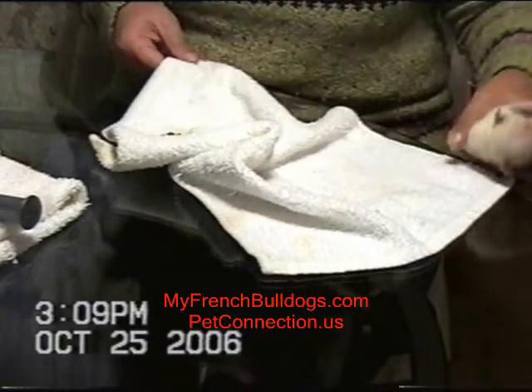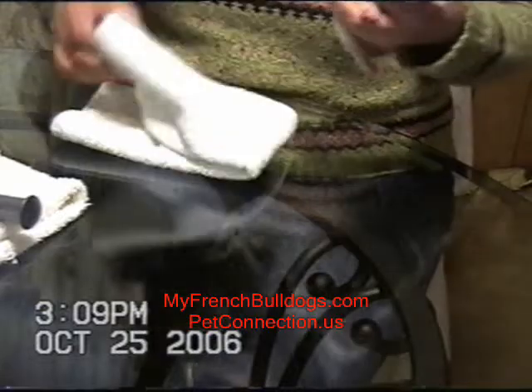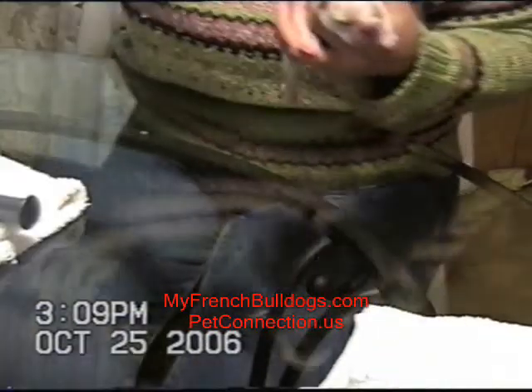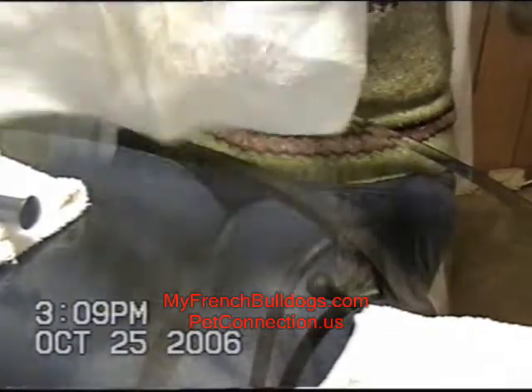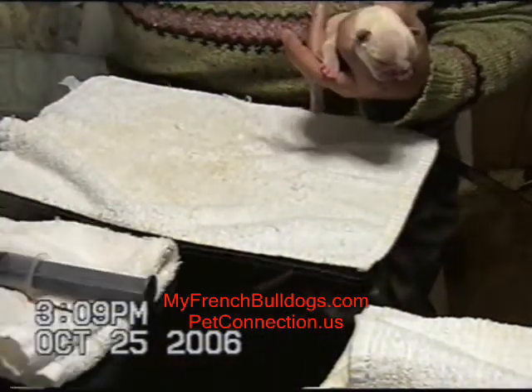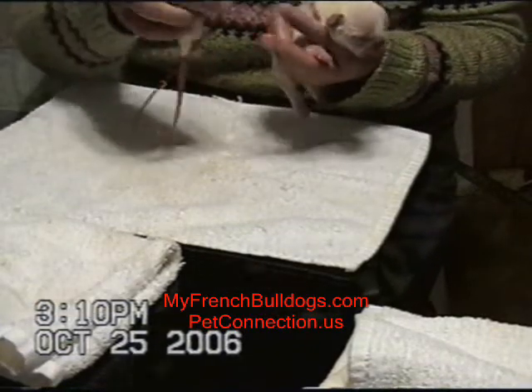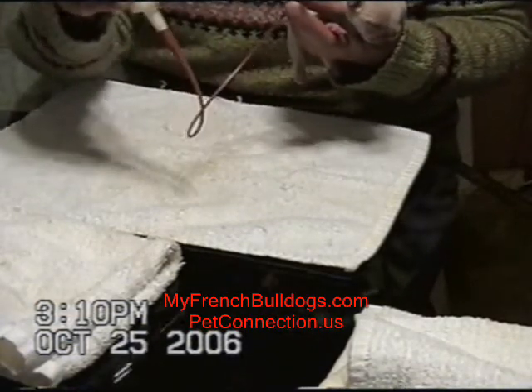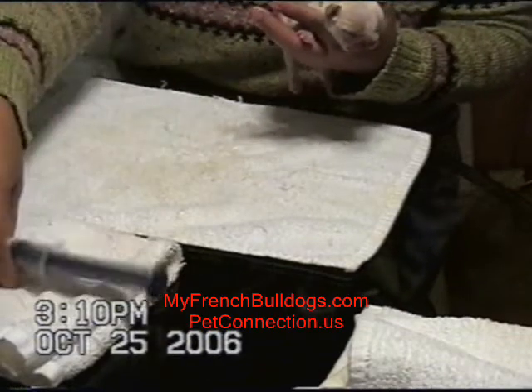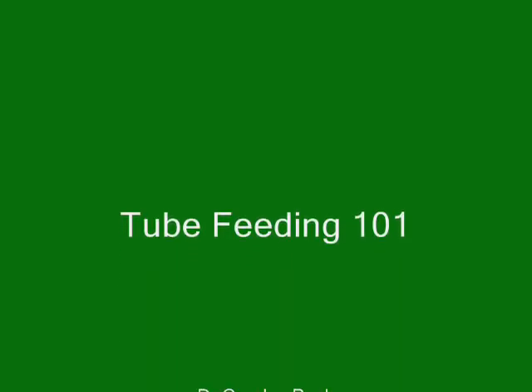Another thing, when you've got more than one pup and they look so much identical like these do, you might want to mark the puppy itself so that you can keep up with who is who. Maybe fingernail polish on the paw, a different paw for each one, to mark who is who, and keep it written down so you know if they're gaining weight or losing weight. And now I'm getting ready for the next puppy. Getting clean towels out. I use a new clean towel each time.